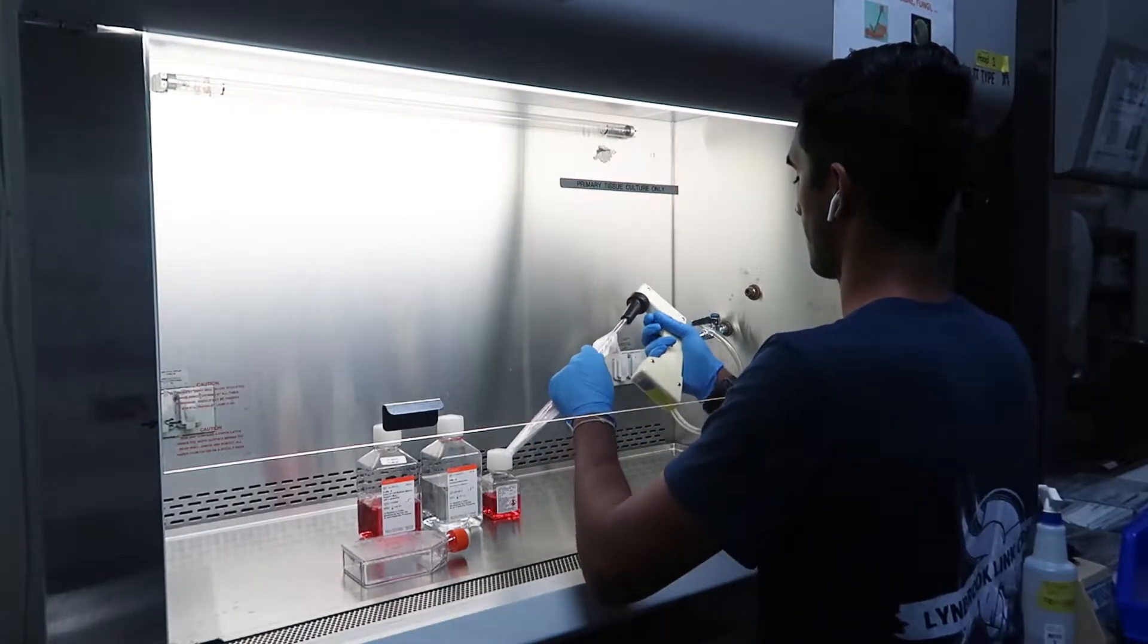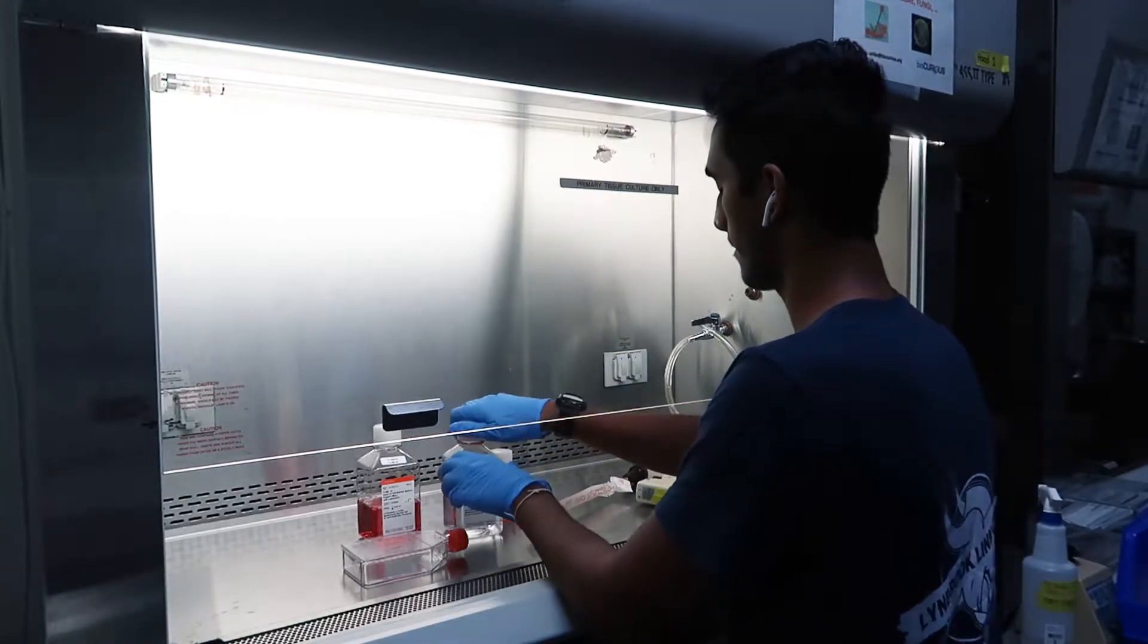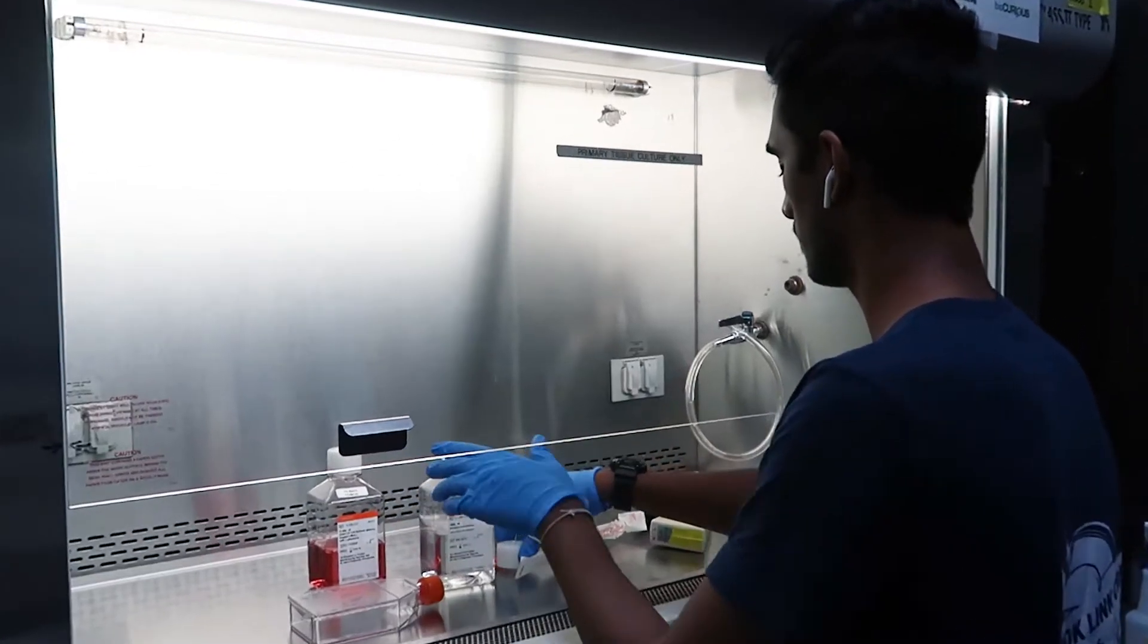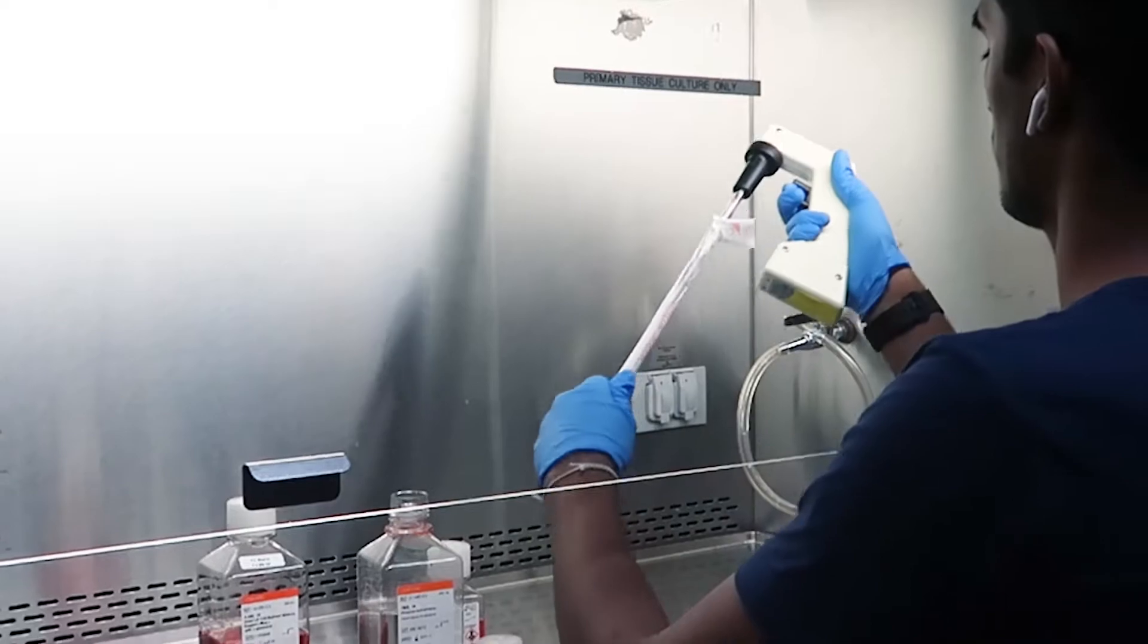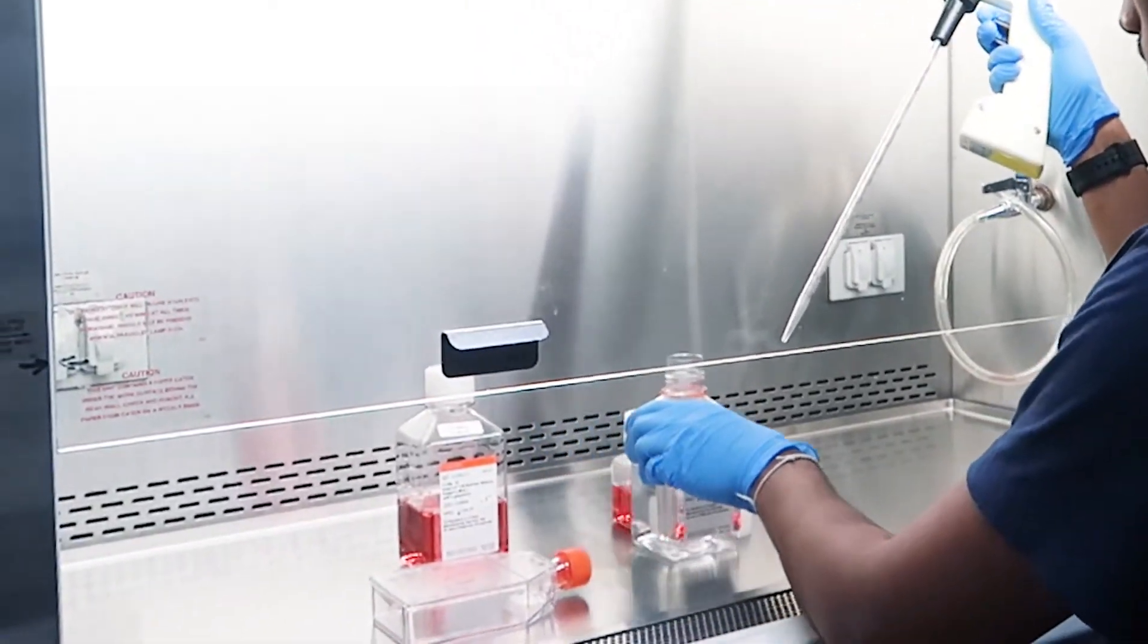Now this next step is going to be using a serological pipette, the serological pipette pump, and one times PBS. We're going to be adding 15 milliliters of this PBS to the flask containing your cells, and this is going to rinse your cells.